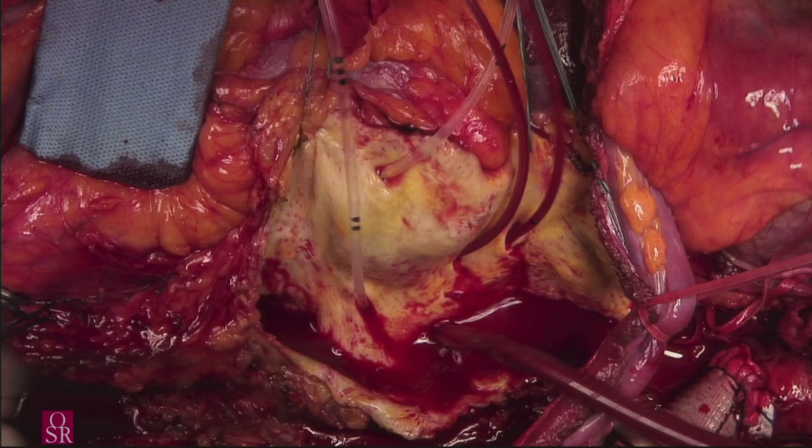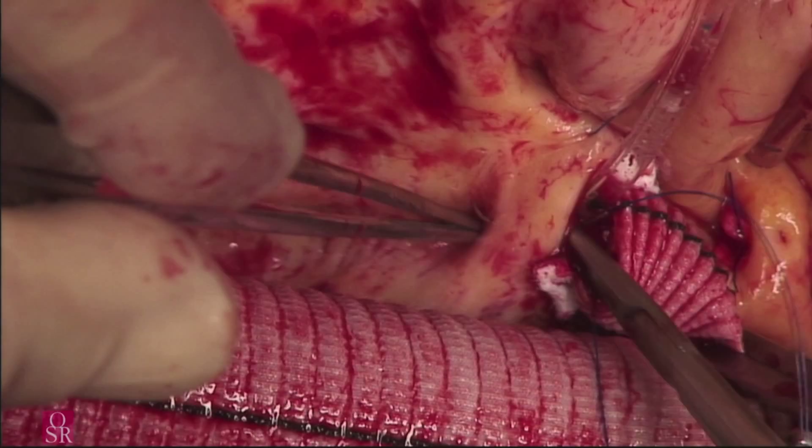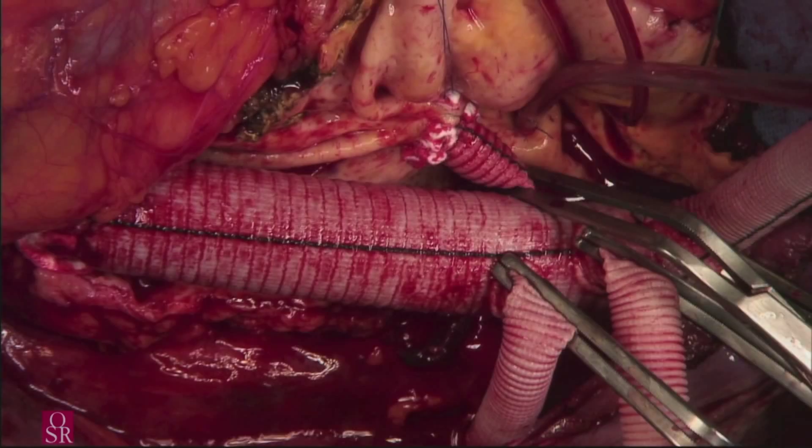When a large amount of native aorta should be included in the repair, a multi-branch graft is usually preferred. This prosthesis allows single vessel reattachment, effectively reducing the risk of recurrent aortic patch aneurysm.